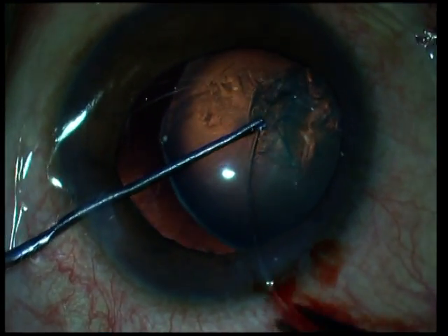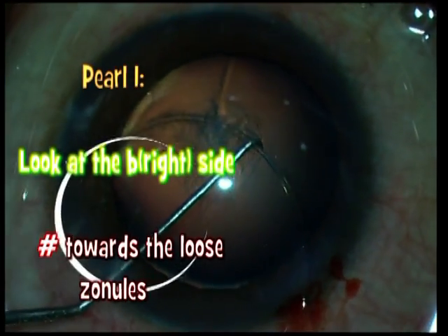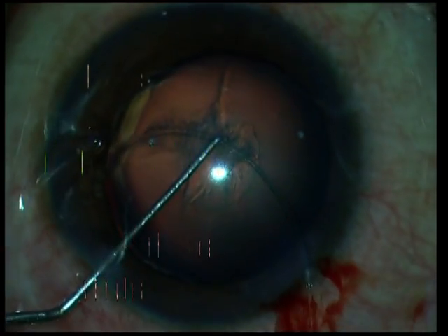Here's a second example where the same mistake is being repeated — the CTR is being pushed away from the zone of dialysis. So here's my pearl 1: always implant the leading edge of the CTR towards the area of zonular dialysis, that is towards the clear red reflex, to prevent the subluxation from extending.